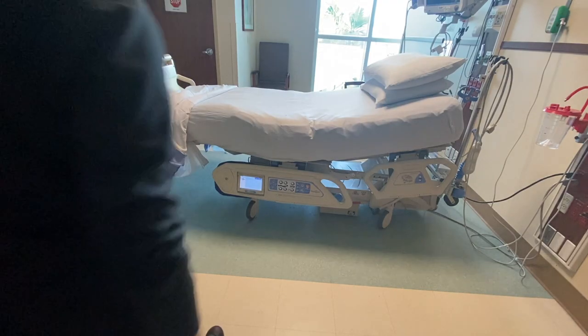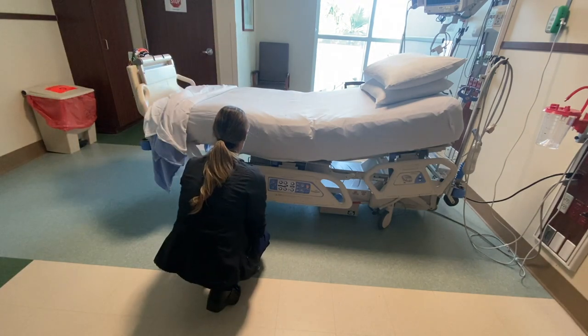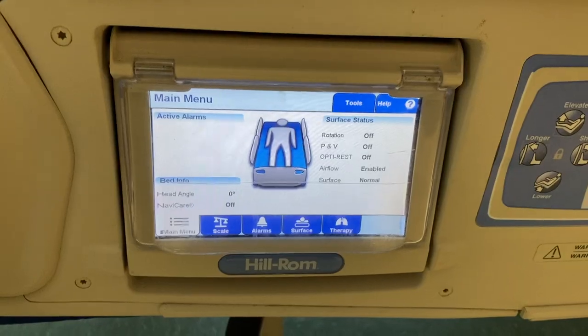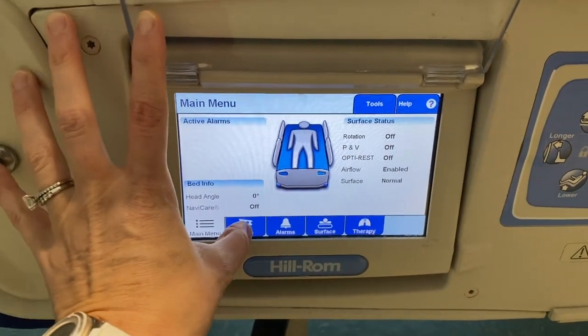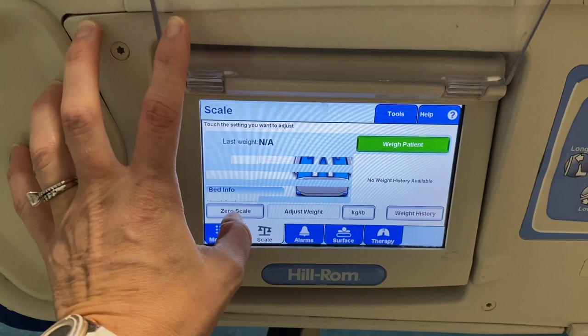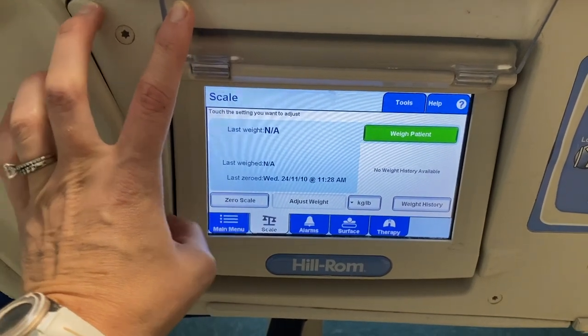First thing I do is I zero the bed. If you have history there, you will want to erase the history, but the history on this one has already been erased. This particular bed, you have to have the head up at least five degrees to zero the bed. So that's what I'm doing now.